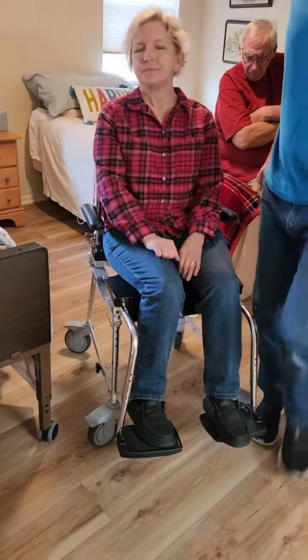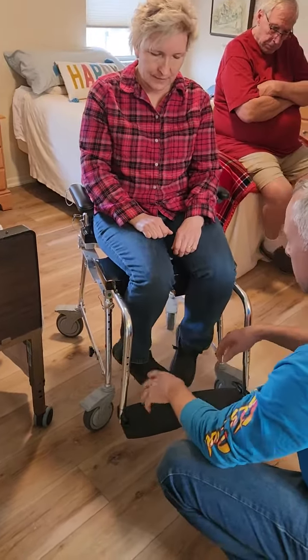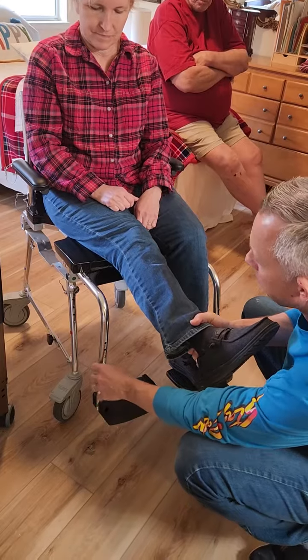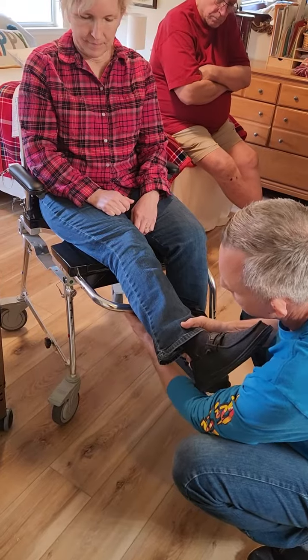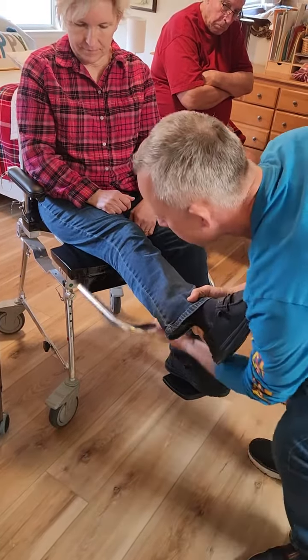The other part I'll show right now is the leg — how the feet come off. To take these off, it's probably easiest to just lift the leg up. This is going to turn, then these things can pop up, and then it's just a turn and pull out.